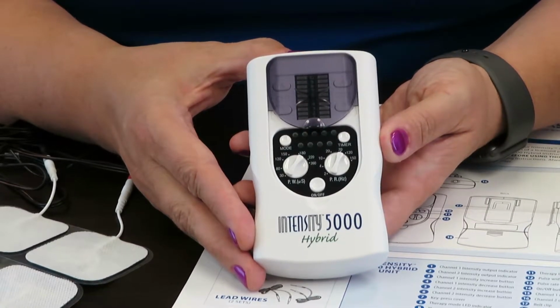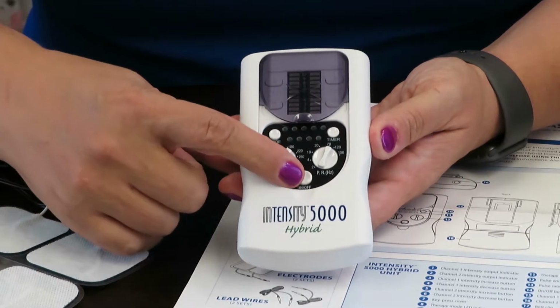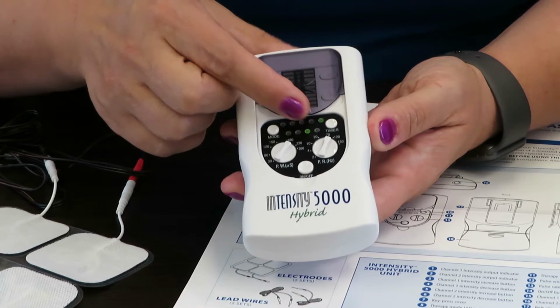Never try to apply or remove electrodes while the device is powered on. This will cause an uncomfortable electric shock. So this is where we're going to power on the device and select the therapy mode. There are 5 therapy modes to choose from.